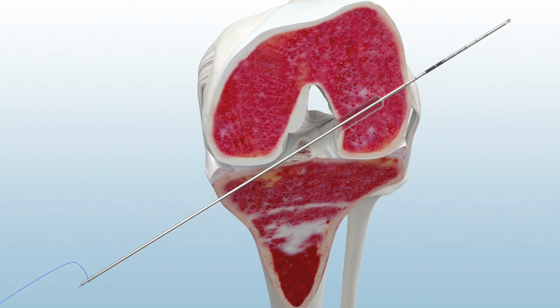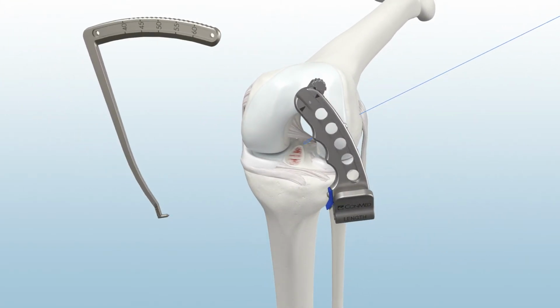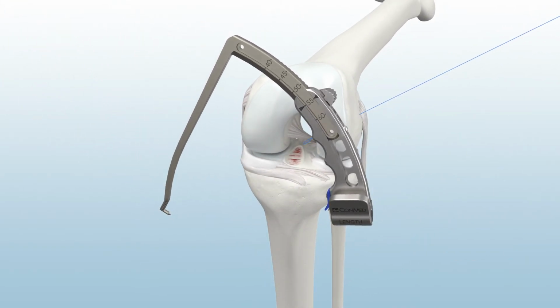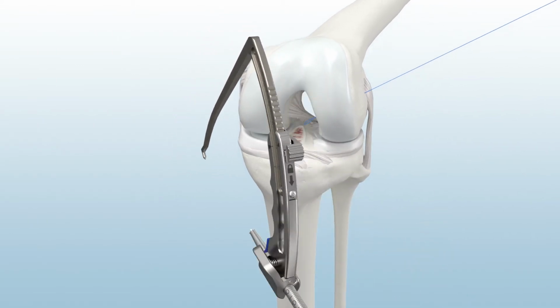Load a passing suture into the guide pin eyelet and pull the guide pin out to advance the femoral passing loop into the joint. Next, assemble the Infinity modular guide system, which features a quick connect mechanism on the guide body and ratcheting edge on the guide sleeve.